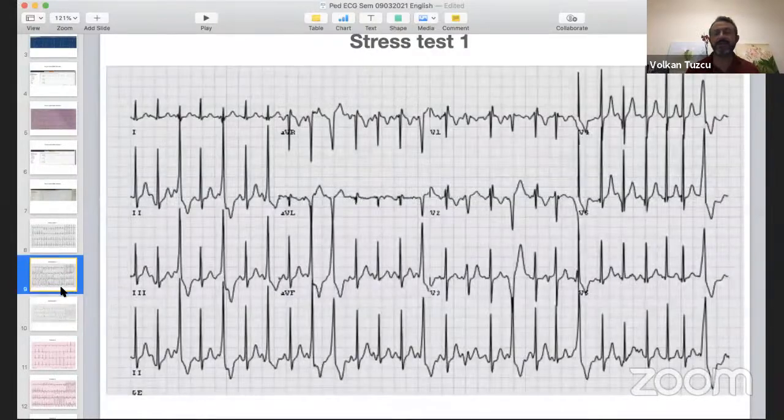So what is the expected heart rate for an 8-year-old when they do a stress test, right? Look at this rate here. That's why I picked this heart rate, this age. It's about 150. That's not even near maximum effort. So the patient stops running early, may not actually show you what you want to see. This is very important. So you shouldn't assume that you did the stress test fine. All what he has is just PVCs. And sometimes actually you may not even see this.